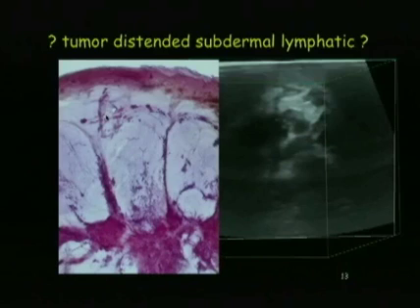Now, there are certain times when the presence of lymph node metastases are going to be higher. And on the left, I've shown a case from Laszlo Tabar's 3D data. I haven't documented that Laszlo let me use this image, but this should say Laszlo Tabar on the bottom. But this is invasive lobular carcinoma invading up Cooper's ligament to the superficial fascia. We believe that most of the skin drains down to lymphatic channels right along the superficial surface of the superficial fascia. And most of the deep lymphatics go upward toward the superficial fascia.